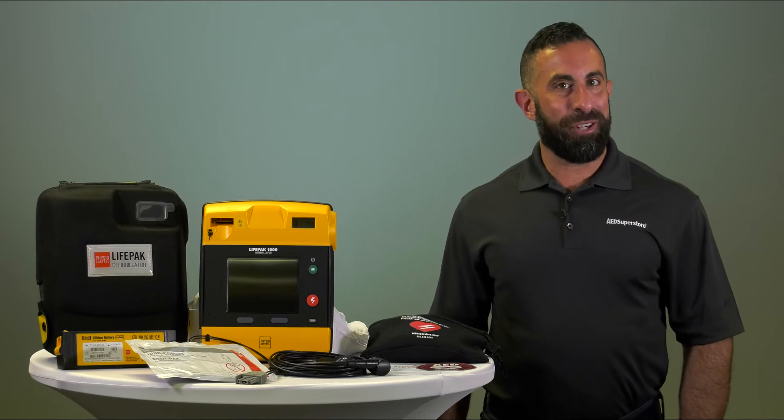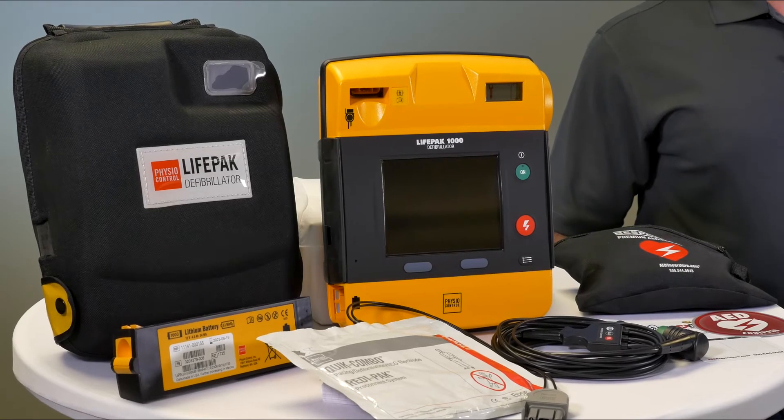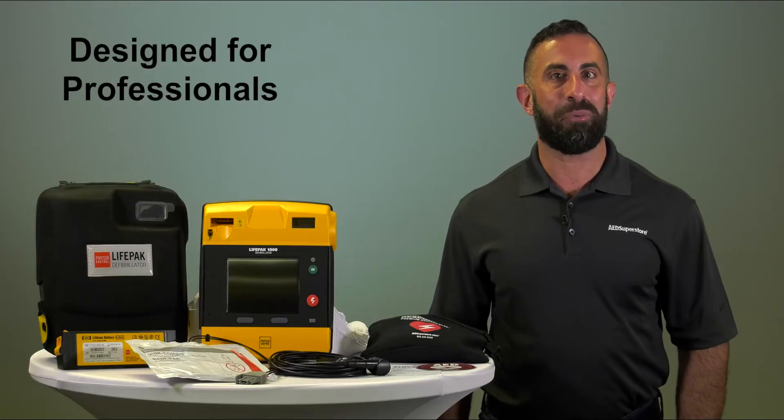Today we're going to talk about the features and benefits of the PhysioControl LifePak 1000. The LifePak 1000 is an easy-to-use automated external defibrillator designed for professional responders.